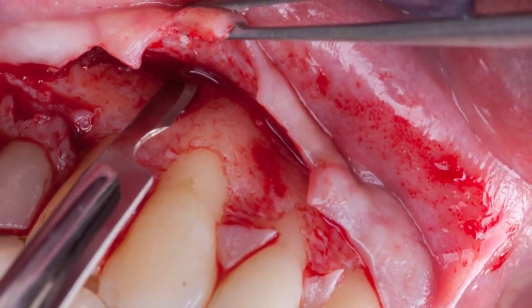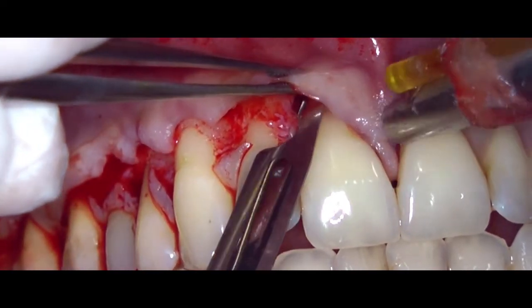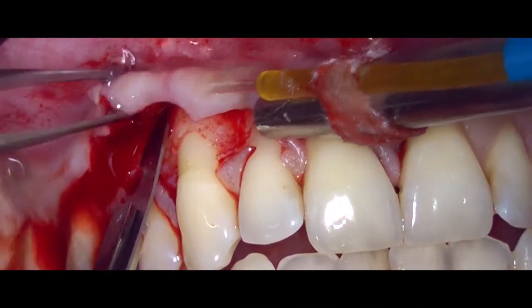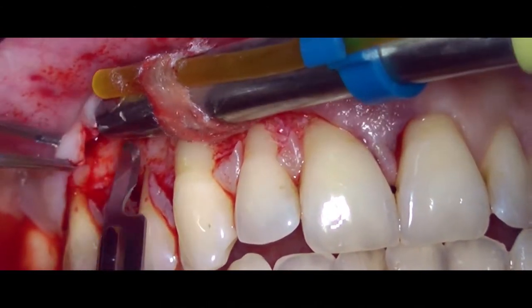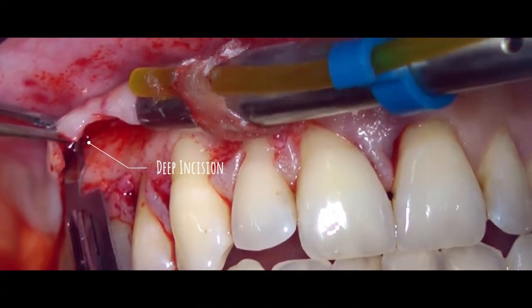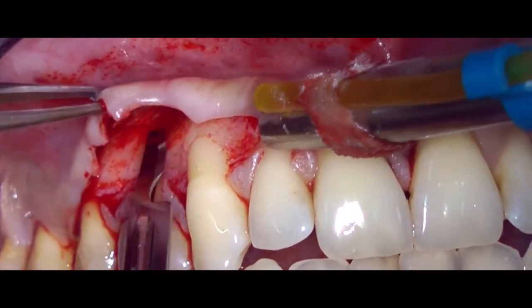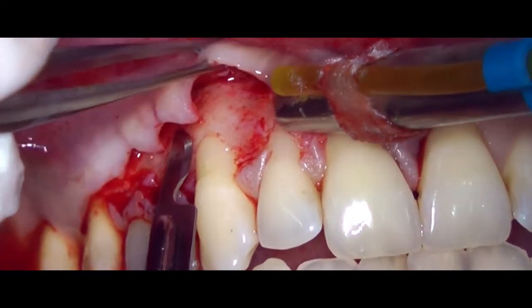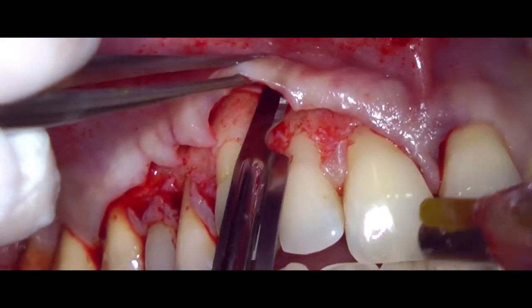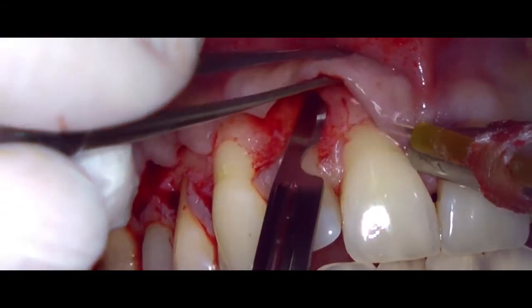Now that we have reflected the tissue for about 3 millimeters, it is time to continue the soft tissue dissection once again in a split thickness fashion, cutting the periosteal muscle insertion. Zucchelli has described this as a deep incision followed by a superficial incision that removes the superficial muscle insertions remaining on the flap. The combination of these two incisions will allow for a complete and effective mobilization of the flap.